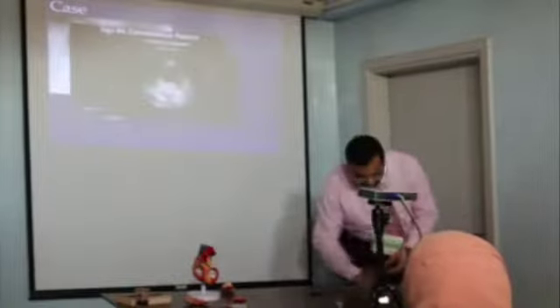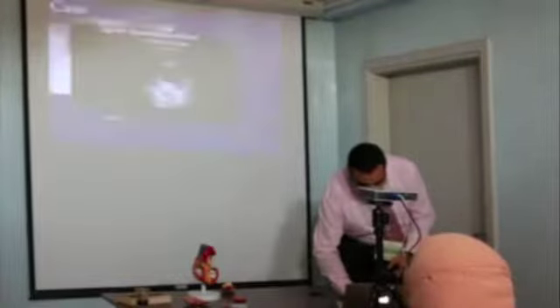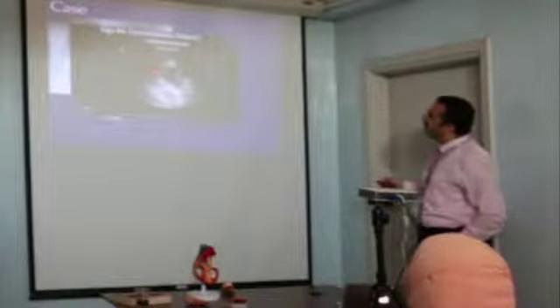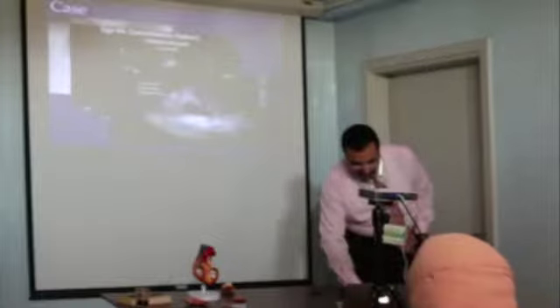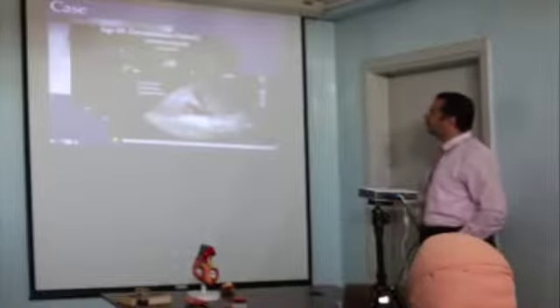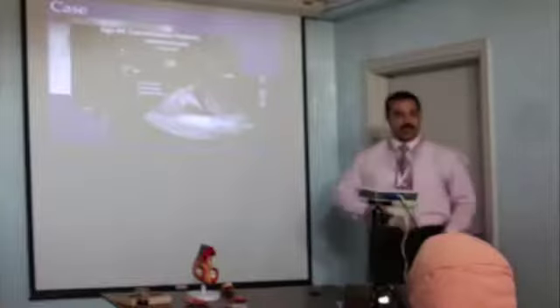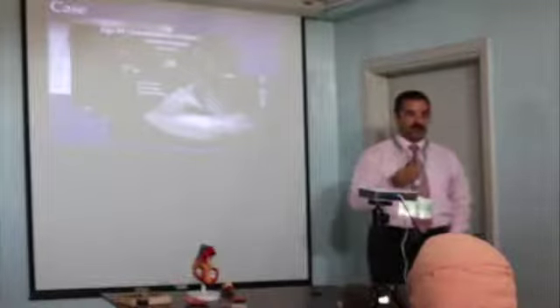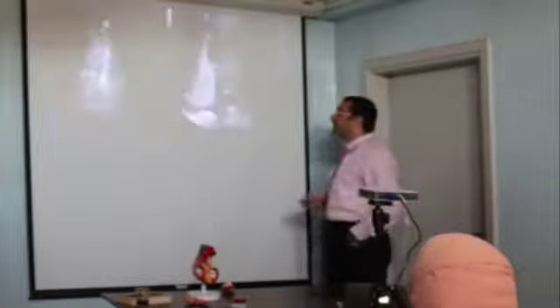Okay? But if it's changing to this one, there is jet black color through here with tissue underneath, so this is effusion. Okay? If you see this one, this is an effusion with collapse with an air bronchogram or dynamic air bronchogram. This is pneumonia with effusion and atelectasis. Do you feel happy to say that on the ultrasound? So, yes, we get more sensitive and specific signs.